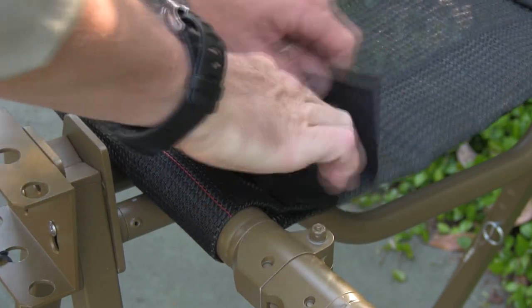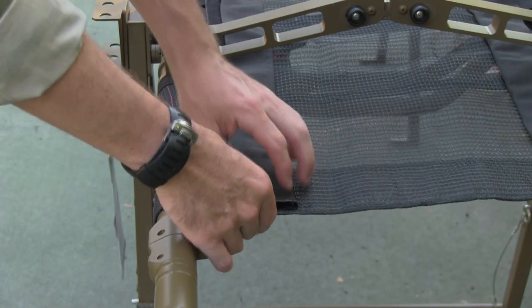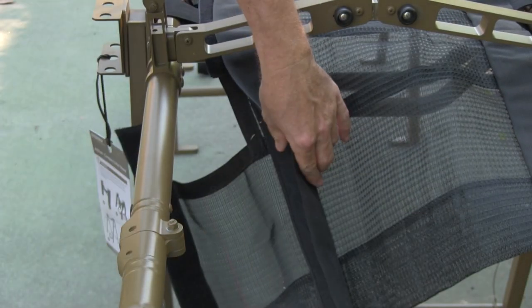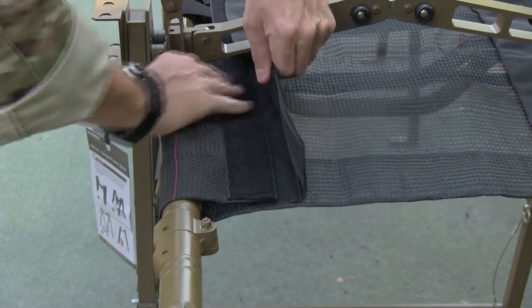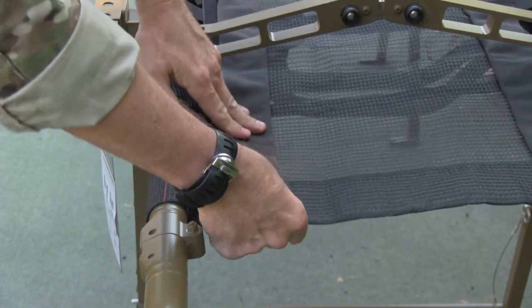A major factor in the low life cycle cost of the APE litter is the removable and replaceable litter bed. No longer is it necessary to replace an entire litter due to a damaged or soiled patient bed. Because of the independent locking frame design, the litter bed can be removed and replaced by end users in a matter of minutes. A variety of litter beds are available to fulfill differing mission requirements.